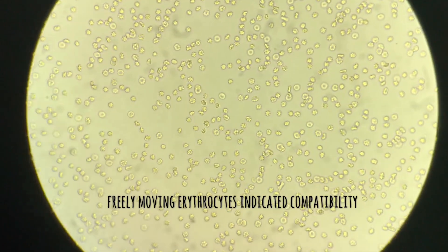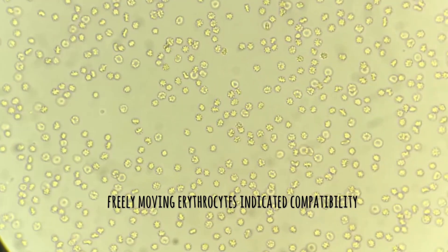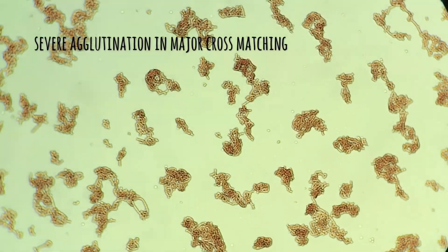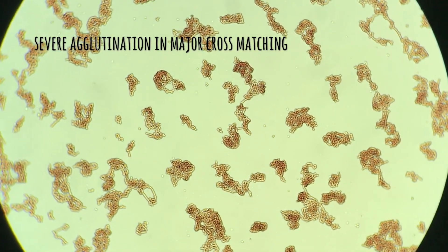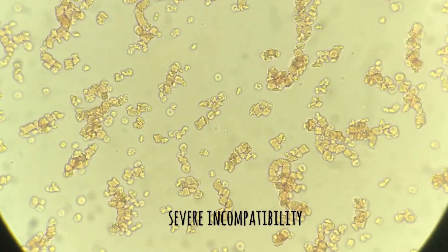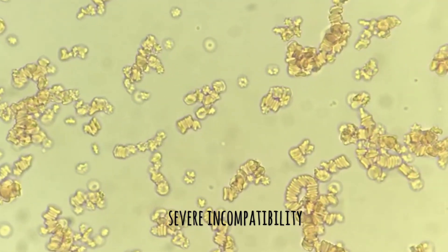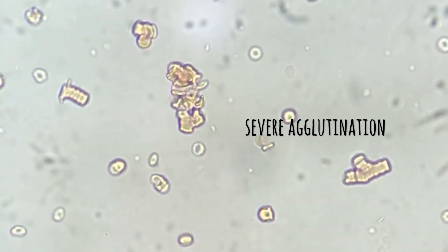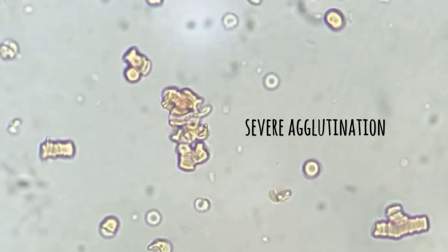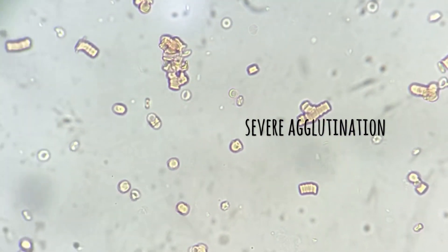A compatible sample will show individual RBCs that are not clumping with each other. An incompatible sample will show RBC clumping under the microscope. If you see RBC clumping in major, minor, or both, then the samples are not fit for transfusion. Agglutination can be differentiated from rouleaux formation by adding a drop of normal saline — rouleaux formation will disintegrate in normal saline, whereas agglutination will remain the same.